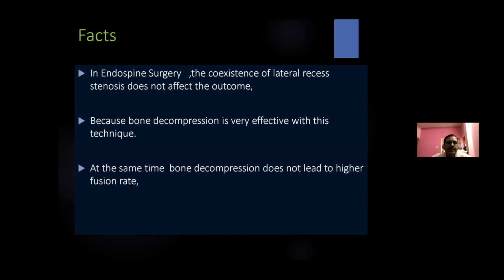Now, maintain this. In endoscopic surgery, the coexistence of lateral stenosis does not affect the outcome because bone decompression is very effective with this technique. At the same time, bone decompression does not lead to a higher fusion rate.